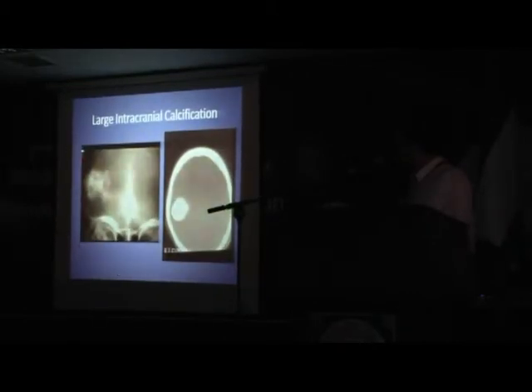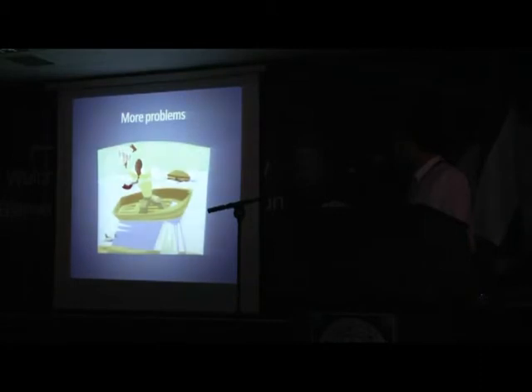On X-rays, sometimes we don't know what we're dealing with. Is this calcification of the bone, the calvarium, or is it inside? When we do the CT scan, you could obviously see that it's in the brain parenchyma. This is not in the skull.